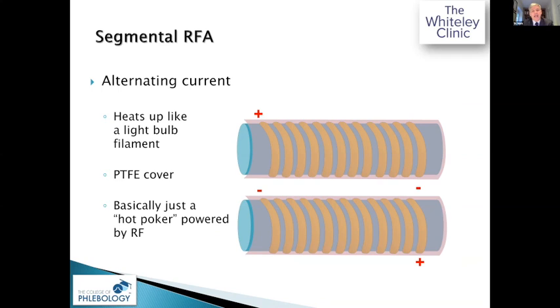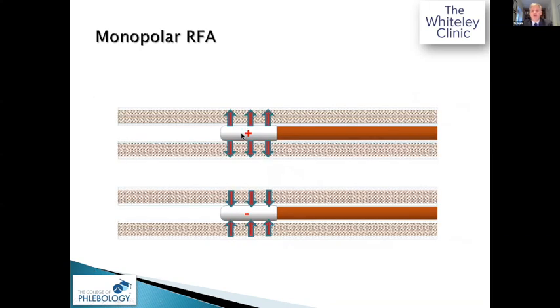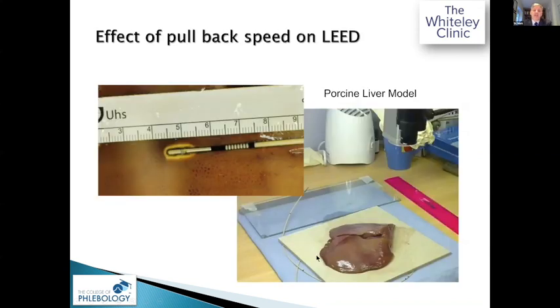So you could use any sort of heat inside that, as long as you could control it to 120 degrees centigrade if you want. So this is not truly radio frequency. In my books and everything, I call this segmental radio frequency, because we must remember we don't put the electricity anywhere near the vein itself. And then we have monopolar radio frequency, where radio frequency goes from the electrode into the body and out again at radio frequency rates, again causing heat. So when we talk about radio frequency, we must remember we're talking about different things.